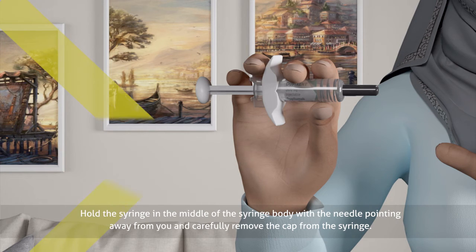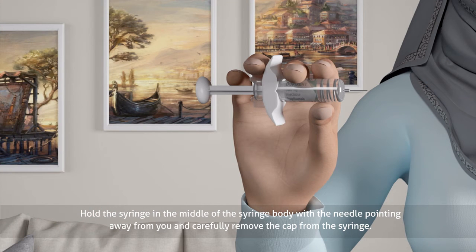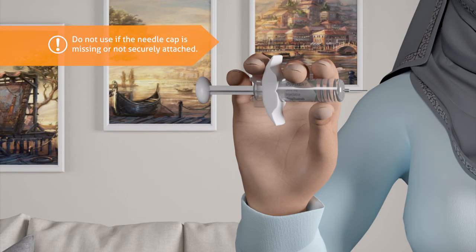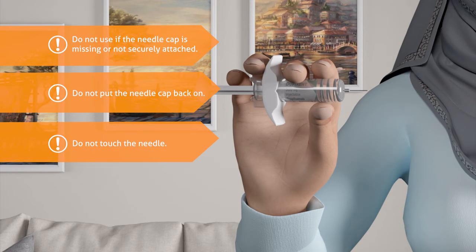Hold the syringe in the middle of the syringe body with the needle pointing away from you, and carefully remove the cap from the syringe. Do not use if the needle cap is missing or not securely attached. Do not put the needle cap back on. Do not touch the needle. Inject the medicine right away after removing the needle cap.